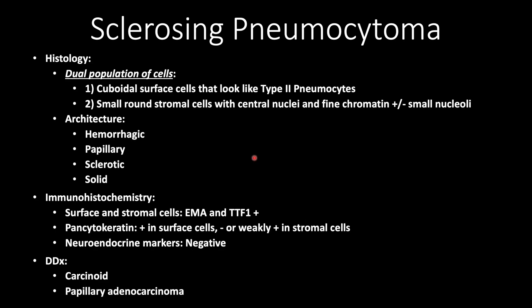Histology — the key is the dual population of cells. You'll have cuboidal surface cells that look like type 2 pneumocytes, and then you'll have small round stromal cells with central nuclei and fine chromatin, plus or minus small nucleoli. Architecturally, you can have predominantly hemorrhagic, papillary, sclerotic, or solid patterns.